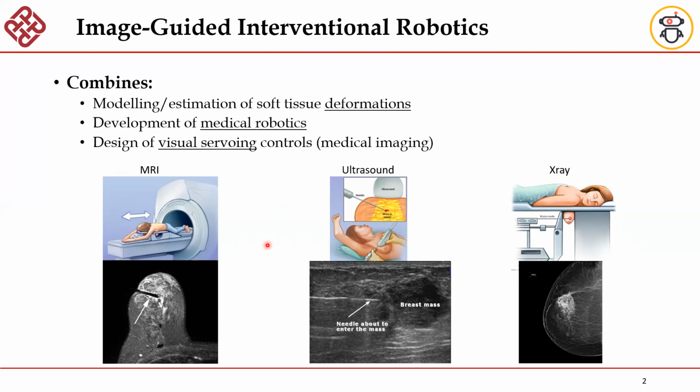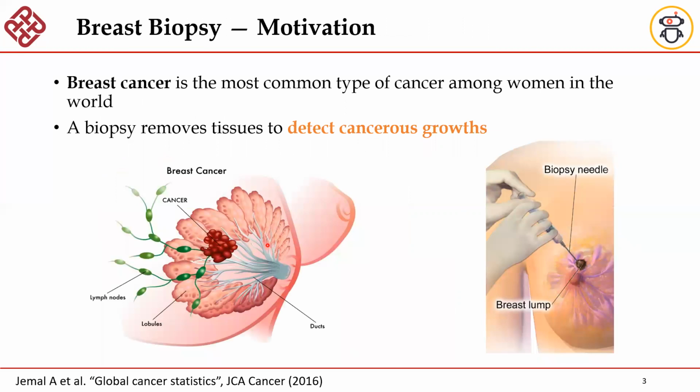For this work, we have been motivated to develop robotic technologies to perform biopsy operations for breast tissue. We know that breast cancer is one of the most common cancers amongst women in the world, so we really have high rates.